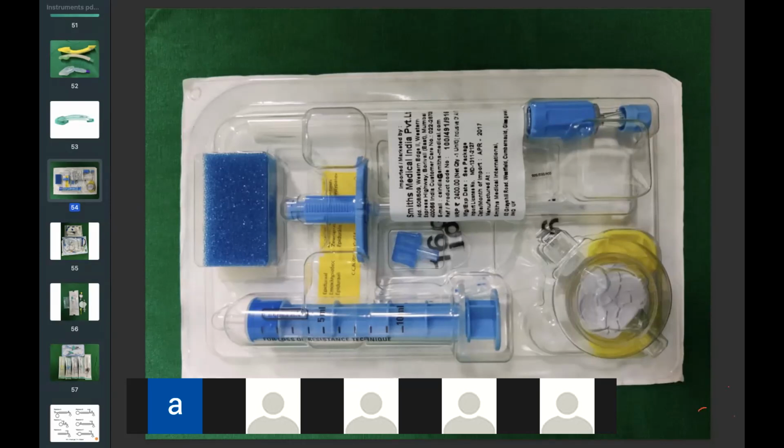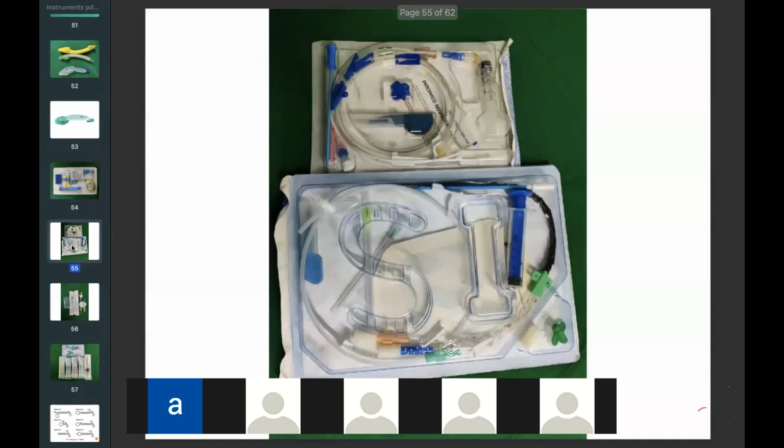Garima? I think Dr. Kiran Chadda had put it on the group, right? A newer method of this with loss of resistance technique where that small bubble is there, and once you enter the epidural, the bubble comes down. Like a small rotating ball was there and then you pass in. Just to remind you that there is this thing. Yes. Another is the hanging drop method.